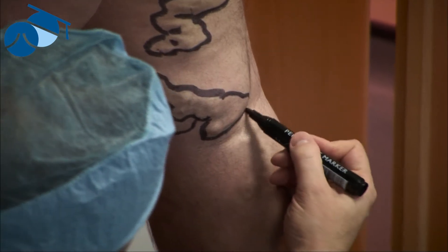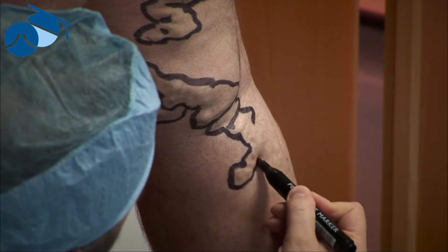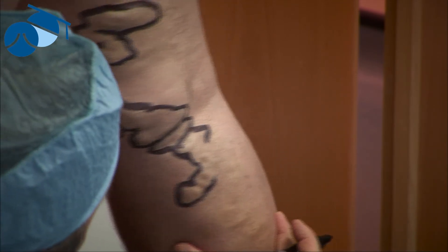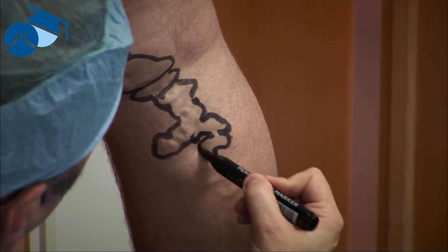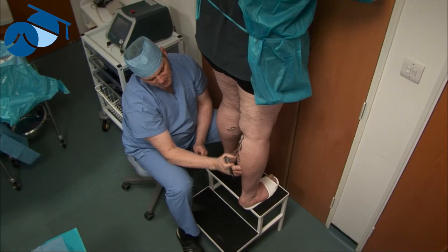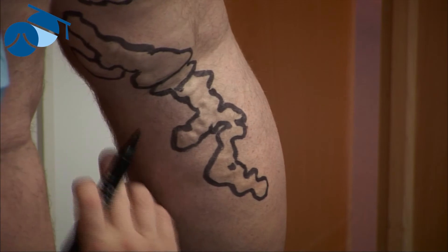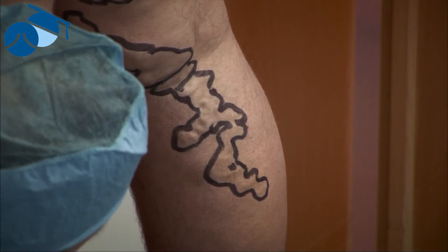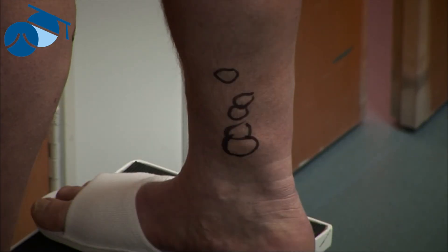When we actually have the patient lying down, the vein is invisible and non-palpable. At this point, we can see the full extent of the varicosities, but there are also non-varicose tributaries going everywhere. We'll be coming back to finish off the small intermediate bits with foam sclerotherapy in the future. For now, we're going to take away these larger varicosities down by the ankle, and that's all ready to go.